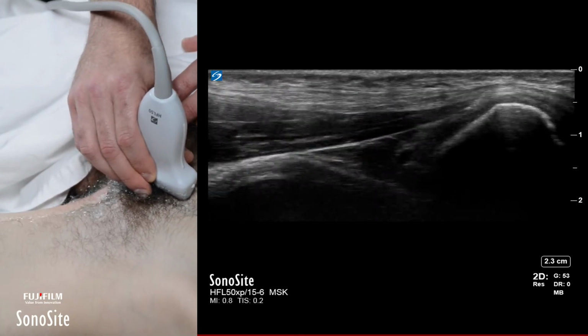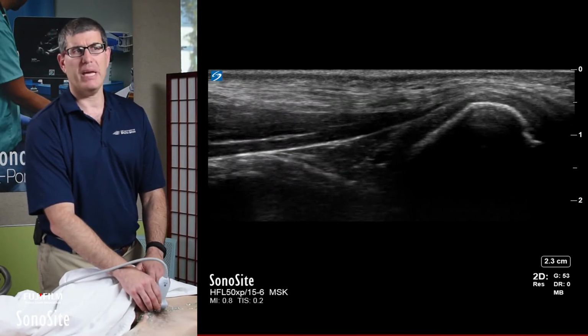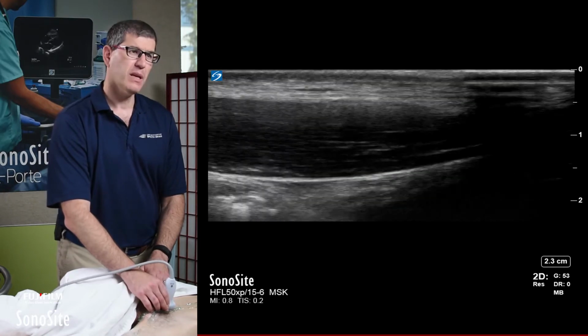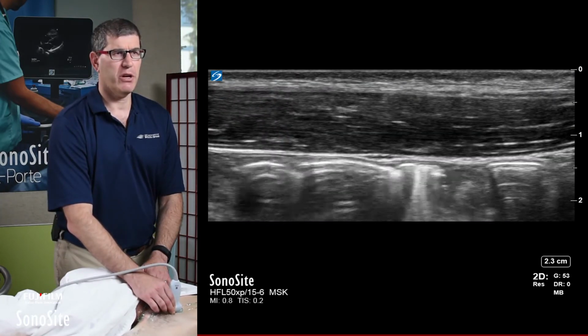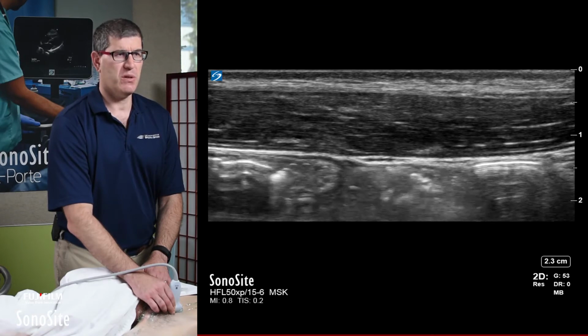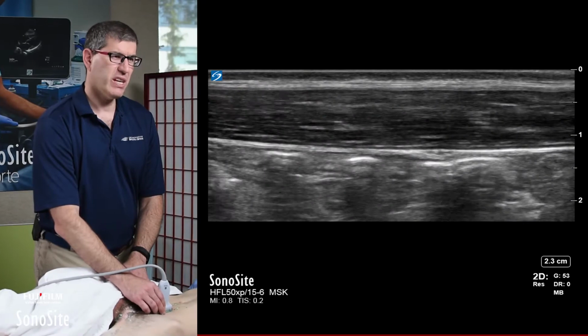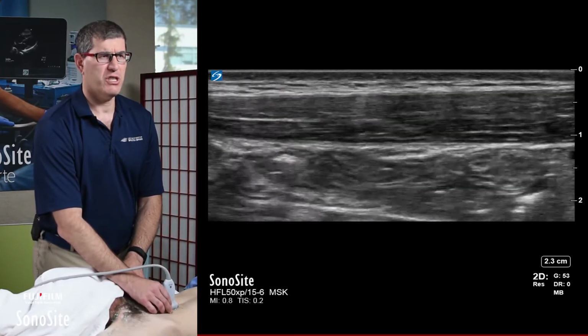Now, I'd like you to think about the adductor longus actually being a continuation of the rectus abdominis, and I want to show you what I mean by that. As I advance more proximally, I can see the gut moving underneath this rectus abdominis. That's him digesting lunch.